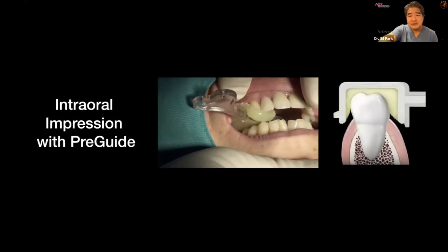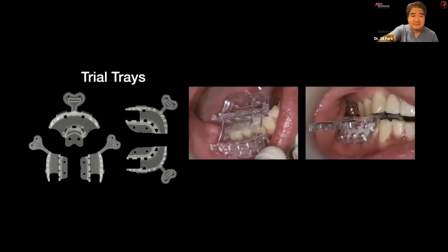Once that is done, as you can see on the diagram, the resin is around the tooth, in the right position, and there is a clear membrane between the tooth and the resin, so it prevents any rocking caused by the undercut area being violated by those resins, right?